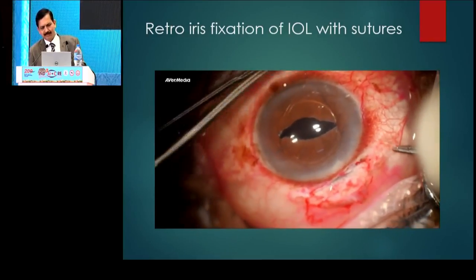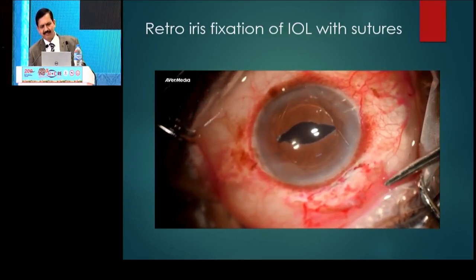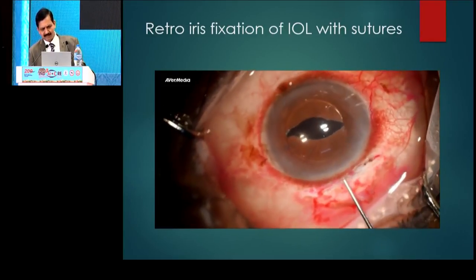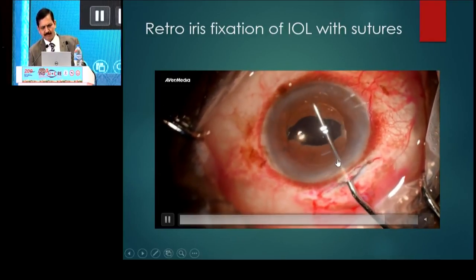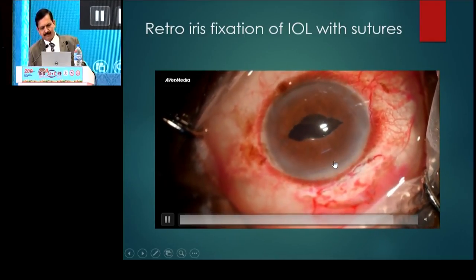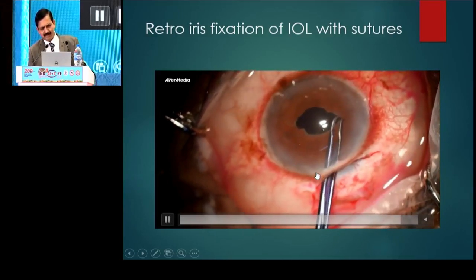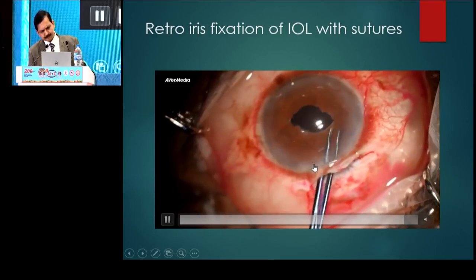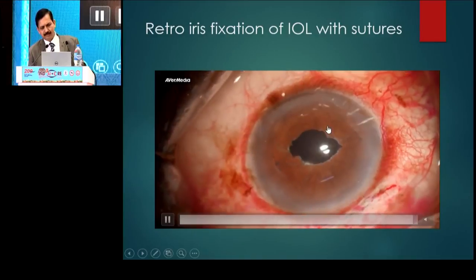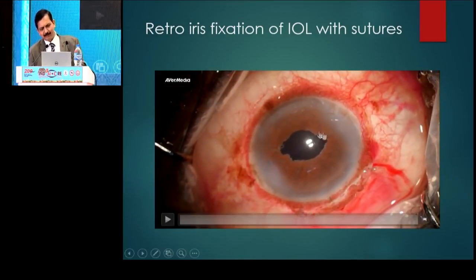9-0 would be better because of more tensile strength, better longevity, and since it's a thicker material than 10-0, handling becomes a little easier. Once you know that both sides are tied properly, then you can put the optic back behind the IRIS. This step is not really required — sometimes that can cut the suture and the knot can open. Though it's an edited video, it takes time.